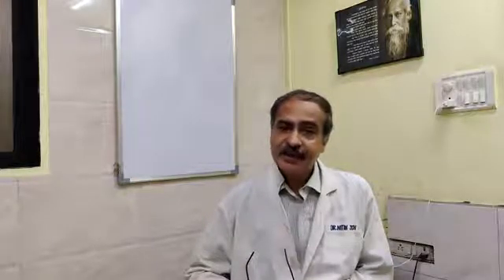Whenever this third curvature is present, while inserting a rigid and straight instrument like the cystoscope sheath or the resectoscope sheath, one has to depress or lower the outer end of the sheath much more than normal. Because of this further depression, the inner vesical end of the sheath gets elevated so that one can pass without injuring into the bladder.